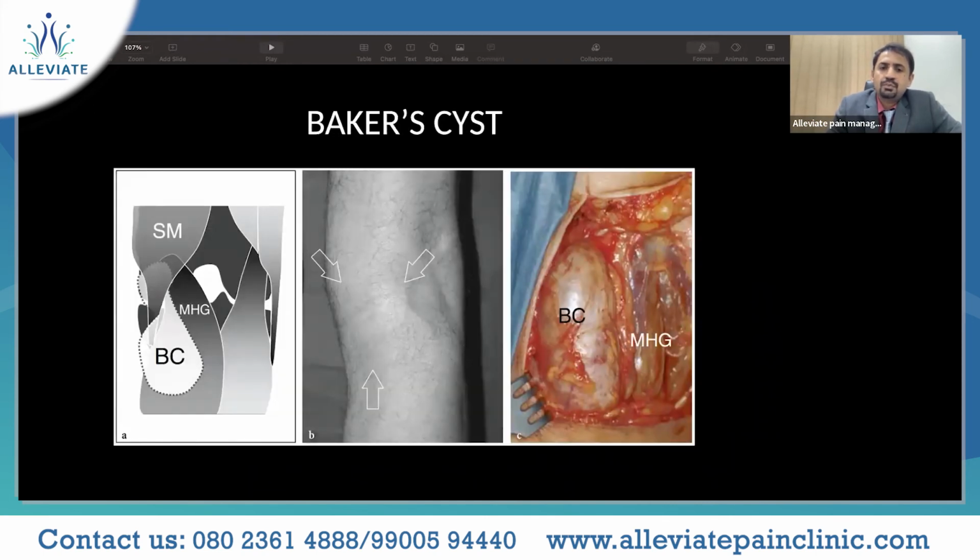Another cause of posterior joint pain could be your Baker cyst. This is a basic schematic diagram, demonstrated also as a diffuse swelling on the posterior aspect, and a surgically opened view of how a Baker cyst looks. So for any posterior joint pain, the assessment of Baker cyst has to be done, and it can be very beautifully appreciated. It is between your semimembranosus and the medial head of the gastrocnemius, where you can find this.